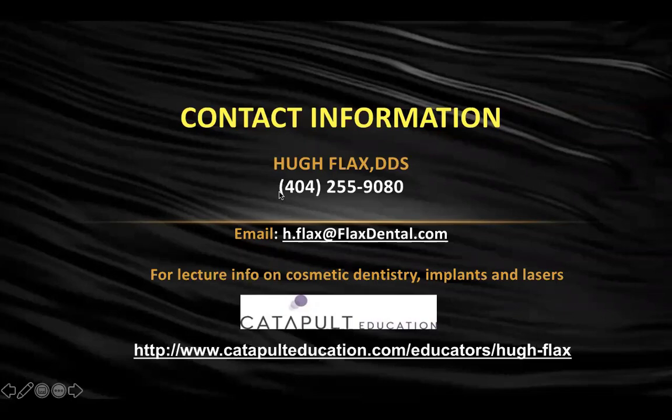I think there's another. Do I recommend packing cord for cementing veneers? I usually prep my cases equigingival, and when I take my impression, if I have to go subgingival, I will go ahead and place cord, but I don't do it during cementation. That's just my style, because my margins are right at the gum line, and that helps quite a bit.